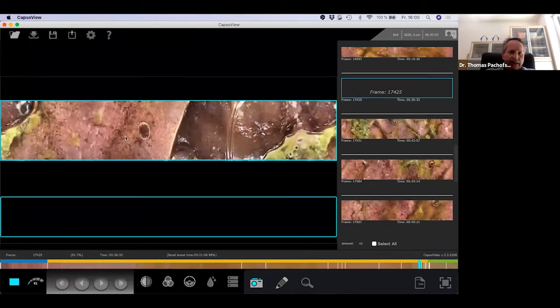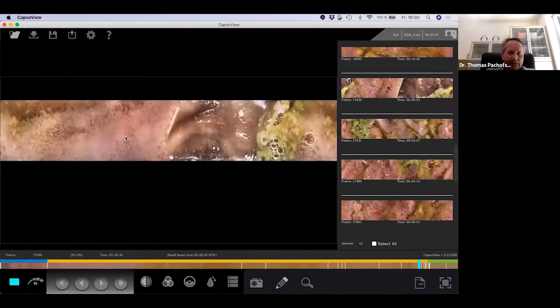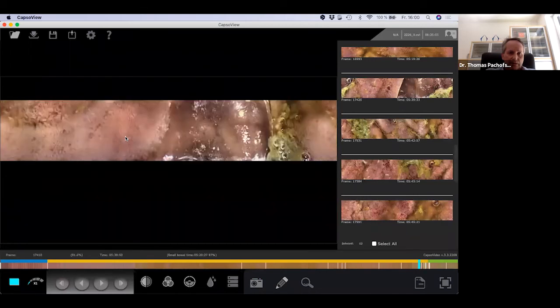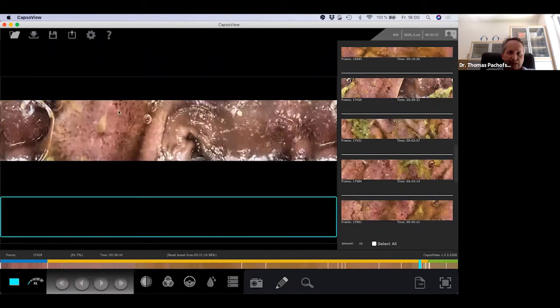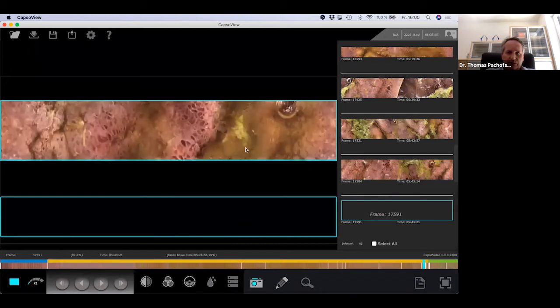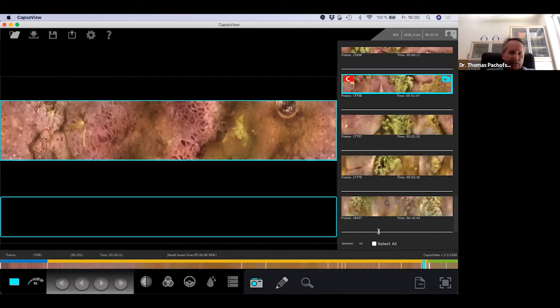We have here again a very big fat villi, and you can see here in an MRI scan the thickened wall as part of the inflammation in this area. We have here an ulceration. So in the terminal ileum, we have a severe inflammation with big fat villi, a thickened wall. But those small lesions from the jejunum, you can't see with another modality.